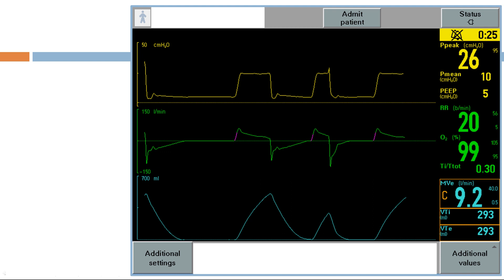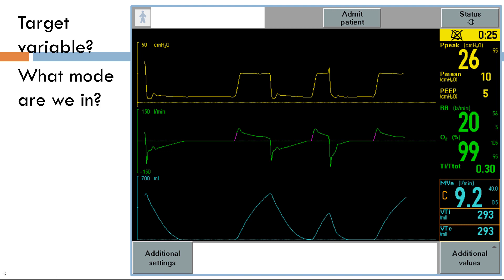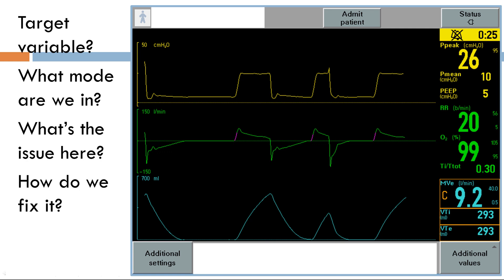Here's a more advanced waveform. First, what's the target variable and mode of ventilation? The flow looks like a dependent variable — something that wasn't directly set — and the amplitude of the pressure is all the same. So the target variable is pressure. If you said pressure control ventilation, that's the number one wrong answer, because in pressure control ventilation the cycle variable is time, meaning the inspiratory time of every single breath should be the same — but it is completely different here.